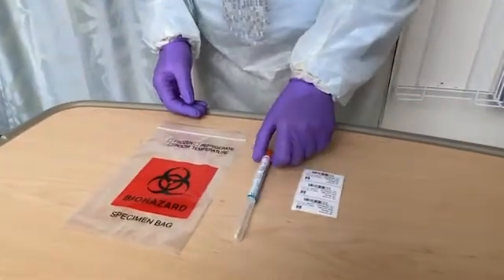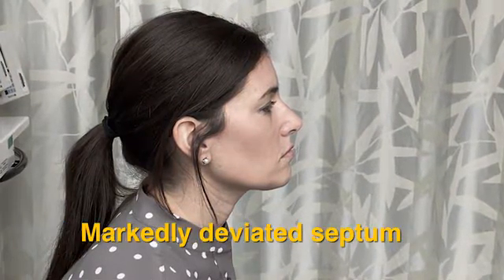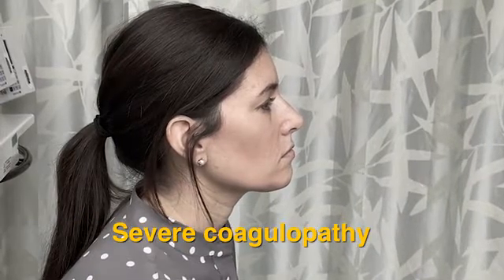There are no specific contraindications for collecting specimens with nasopharyngeal swabs. However, clinicians should be cautious if the patient has had recent nasal trauma or surgery, has a history of a markedly deviated nasal septum, chronically blocked nasal passages, or severe coagulopathy.